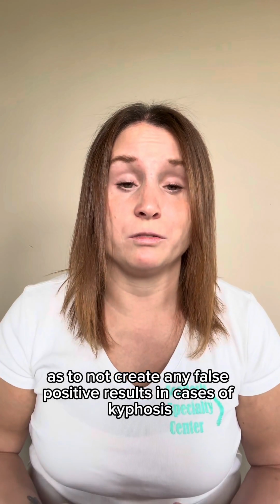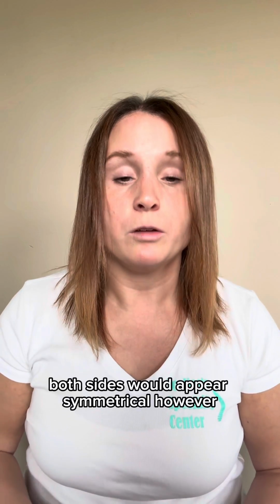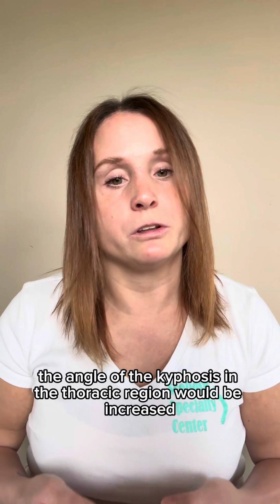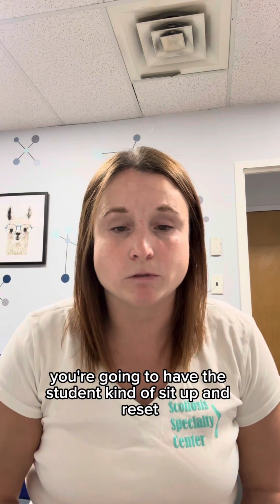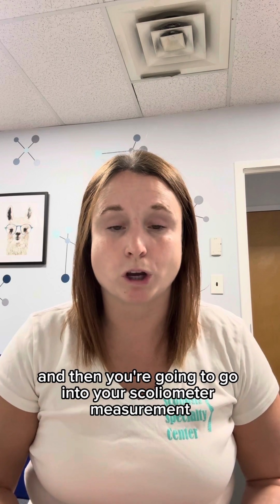In cases of kyphosis, when we're doing the Adams forward bend test, both sides would appear symmetrical. However, the angle of the kyphosis in the thoracic region would be increased. So after you've done the Adams forward bend test, you're going to have the student sit up and reset, and then you're going to go into your scoliometer measurement.